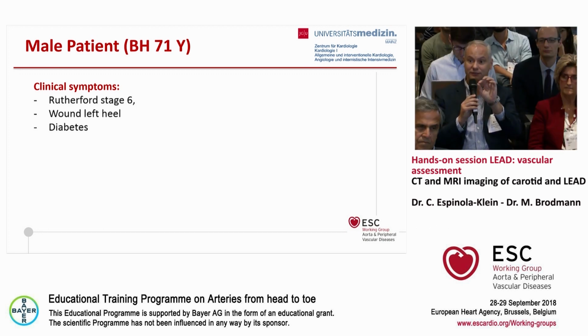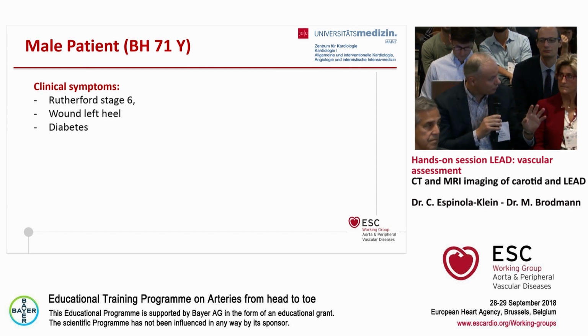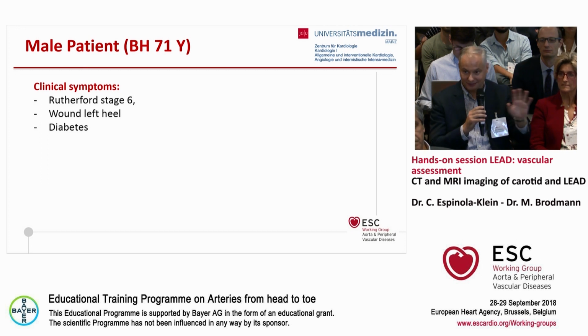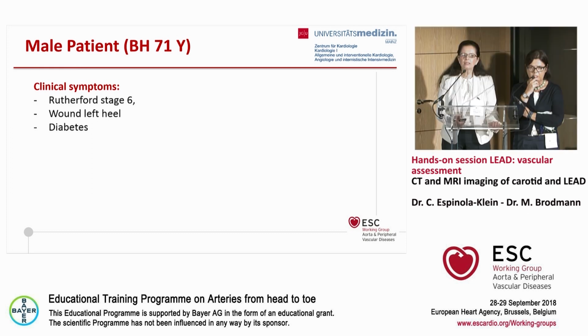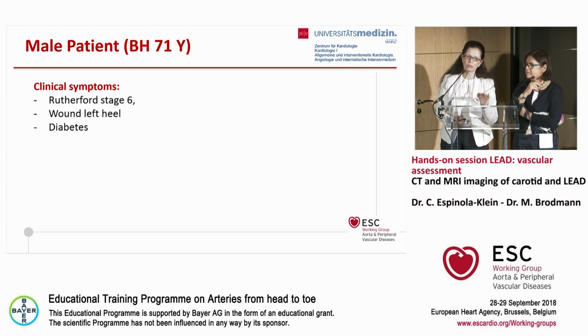The MRI is far better for below the knee lesions. And I need time to convince my surgeons, but nowadays they accepted it. But I need time, a couple of years. But nowadays with these techniques and MRIs for below the knee lesions, it's excellent. It's comparable to standard angiography. And maybe you need somebody who makes you a good MRI scan. Not everybody makes the same quality of images.